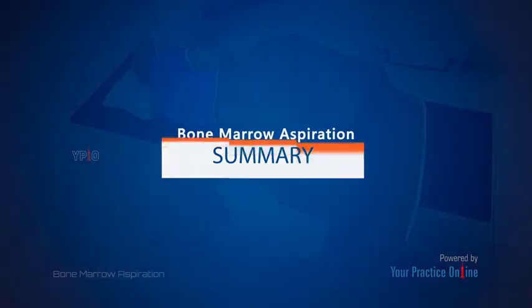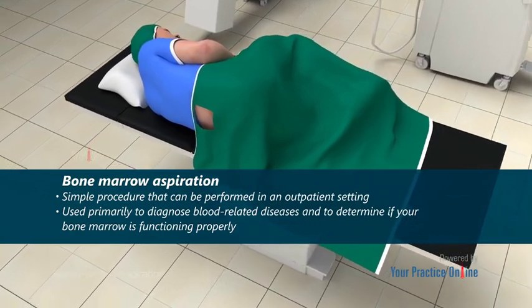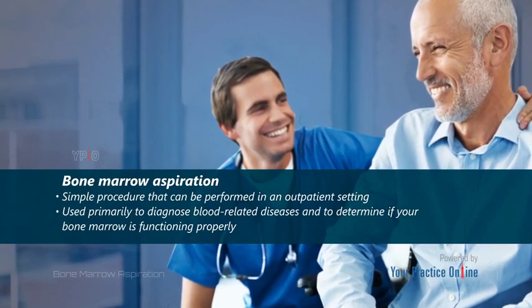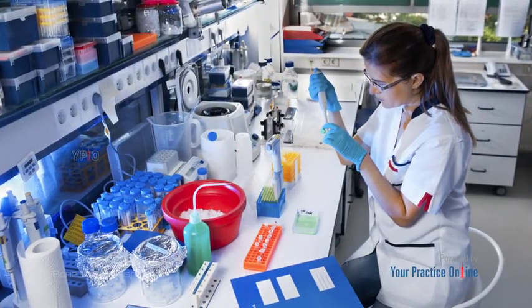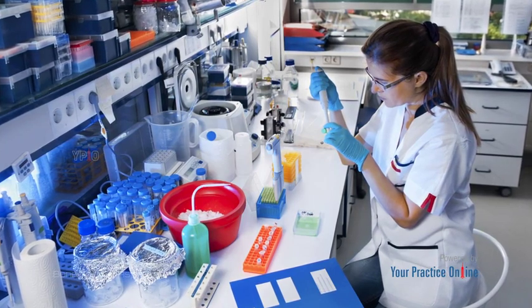Summary. Bone marrow aspiration is a simple procedure that can be performed in an outpatient setting. It is used primarily to diagnose blood-related diseases and to determine if your bone marrow is functioning properly. The sample of bone marrow will be tested by a pathologist to help establish a diagnosis and select the most appropriate treatment.